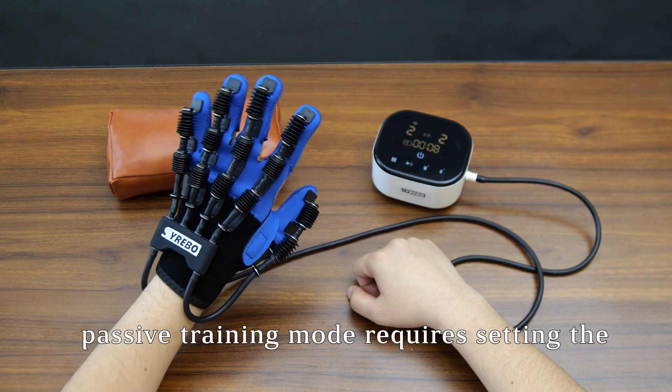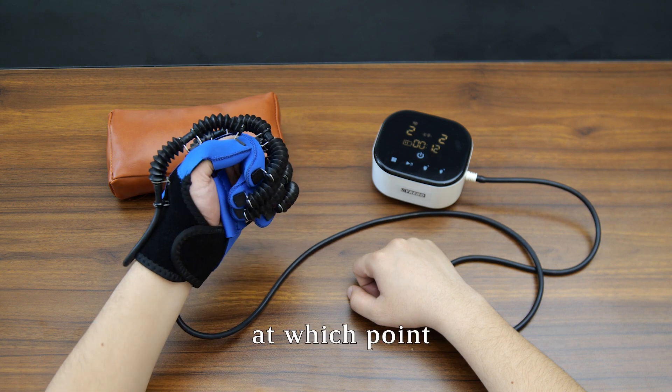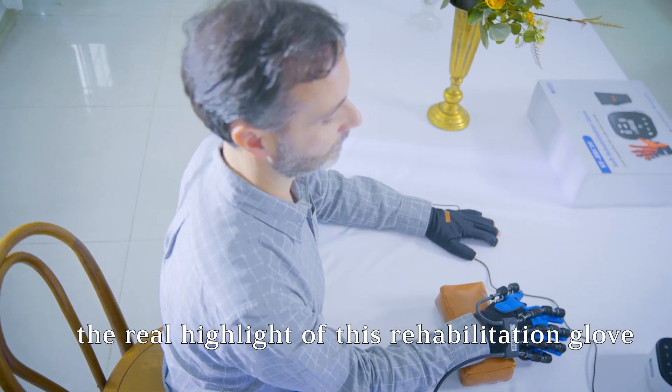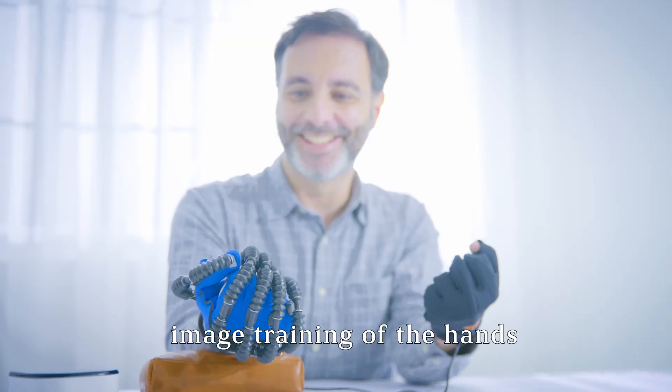Passive training mode requires setting the opening and grip times on the host, at which point the robot will perform the rehabilitation exercises on its own. The real highlight of this rehabilitation glove is the innovative mirror image training of the hands.